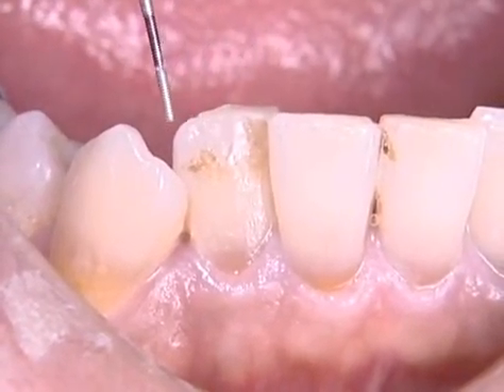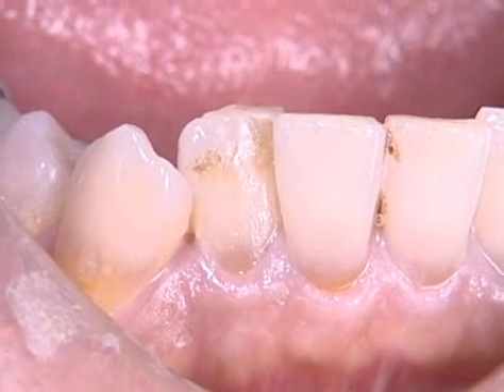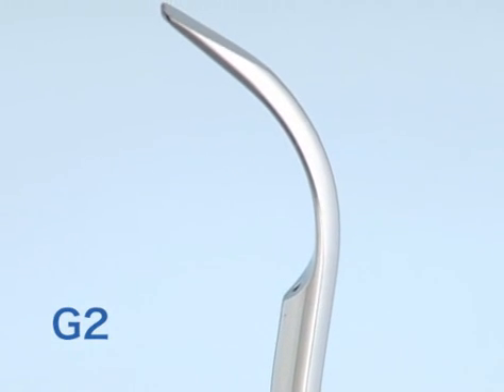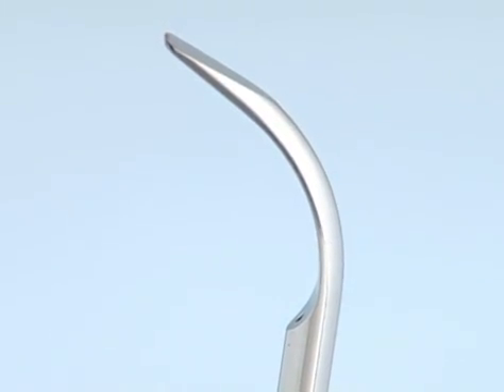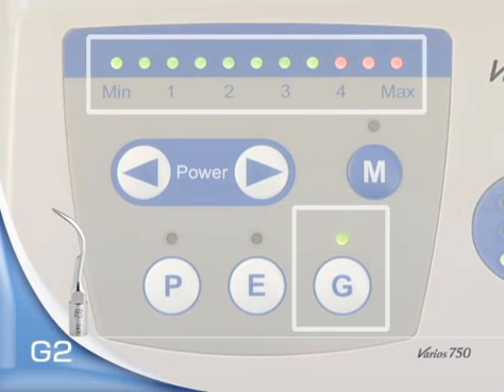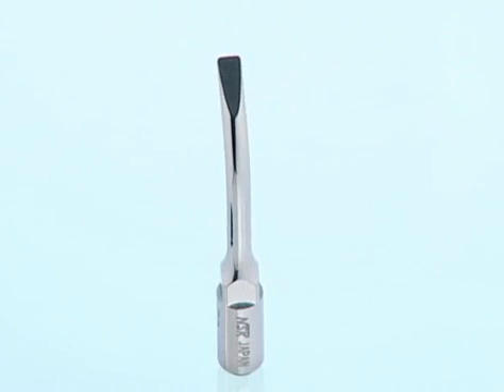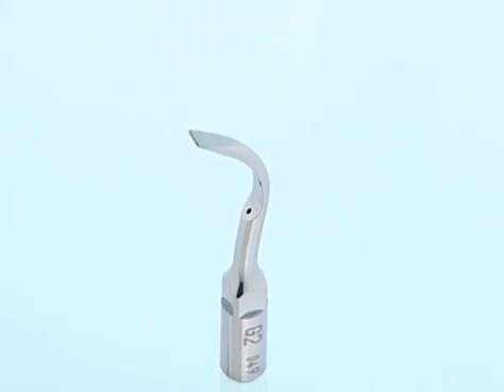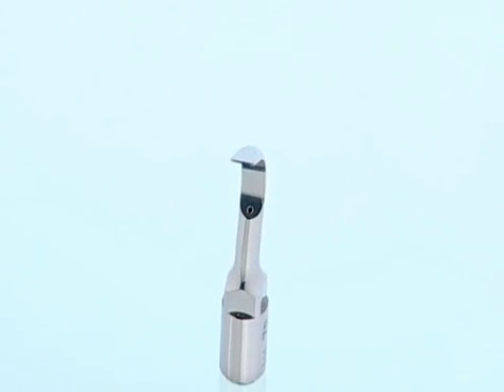Tooth stain is observed on the labial surface of the mandibular right lateral incisor. Tip G2 is used with Varios 750. Power is set at G mode, minimum to maximum. With its flat tip, G2 is suitable for extensive stain removal.